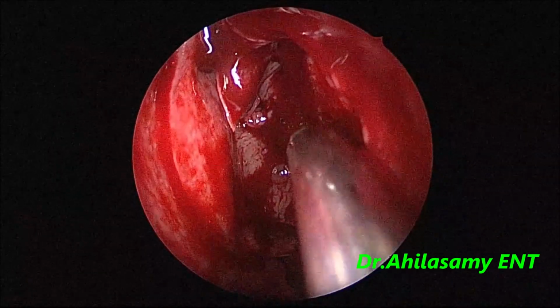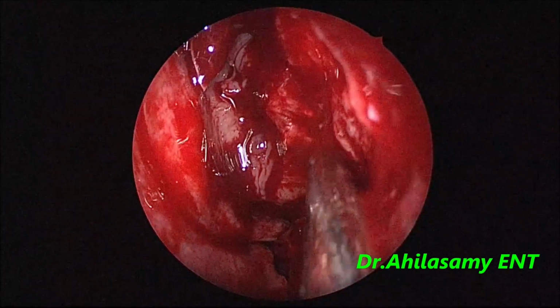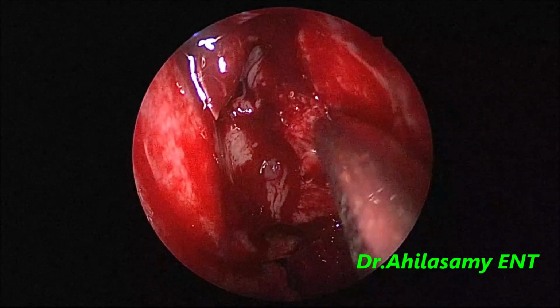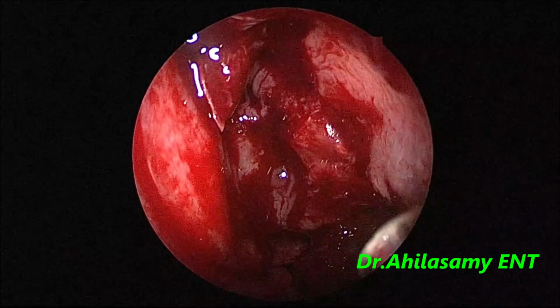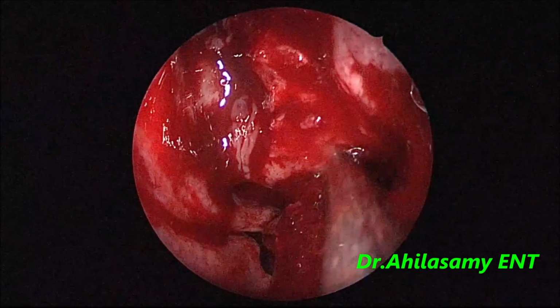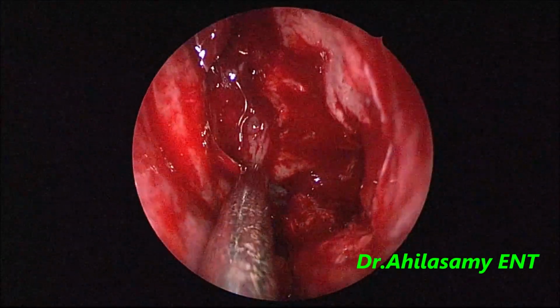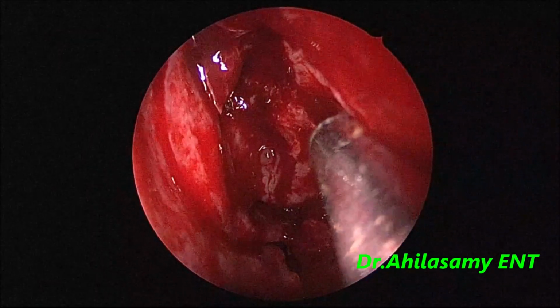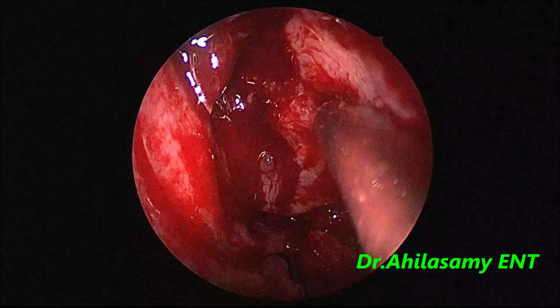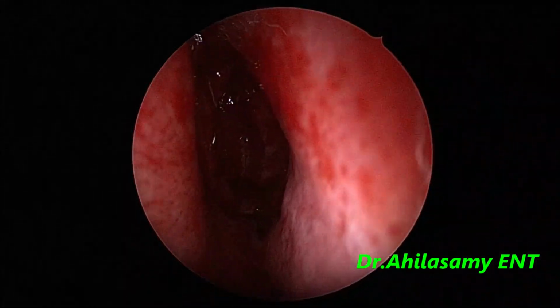But there is some blood trickling from the anterior ethmoids. You can see the blood trickling from the anterior ethmoids. A small vessel is there because of inflammation. There's a proliferation of the vessel. Don't go for cautery. You can just pack it with the same roller gauze soaked in adrenaline and 4% lignocaine in the ratio 1:1, and I will stop it. If it doesn't stop, then only cautery.